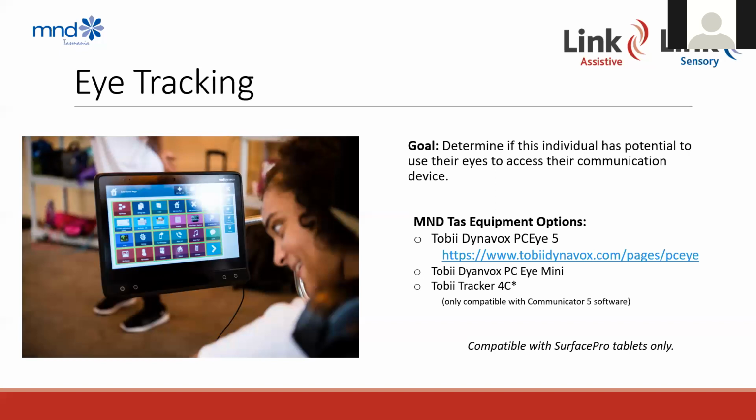Also, all of these eye tracking technology options are only compatible with those Surface Pro tablets. So you aren't able to use them with the iPad, only the Surface Pro option.